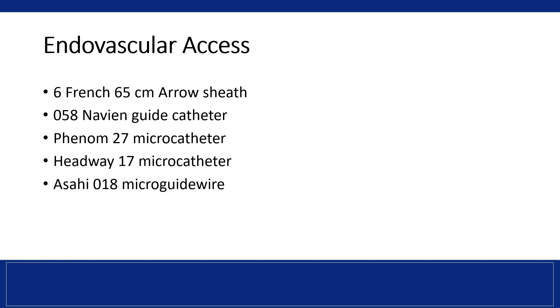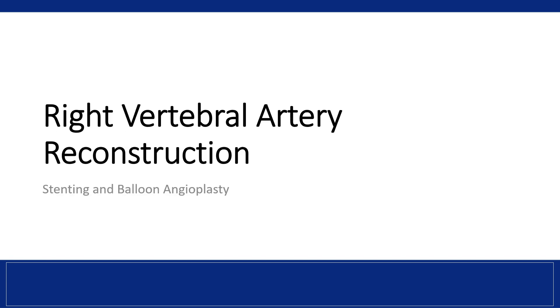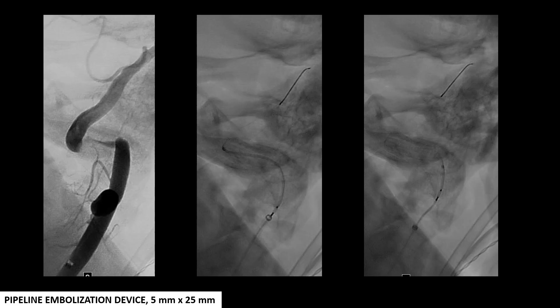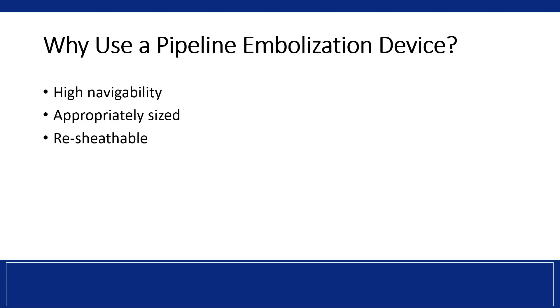Endovascular access was achieved through a triaxial support setup. Right vertebral artery reconstruction was addressed first. A pipeline embolization device measuring 5 mm by 25 mm was successfully deployed across the stenotic segment. A pipeline embolization device was chosen specifically for its high navigability, its available sizing, and ability to be resheathed.